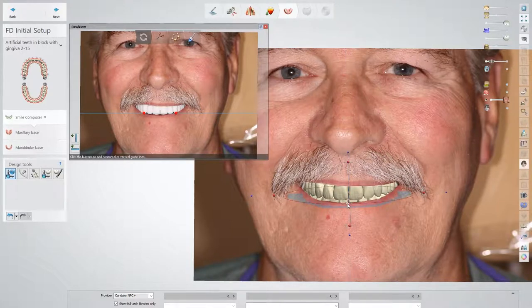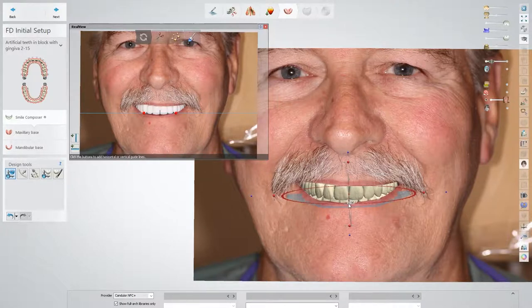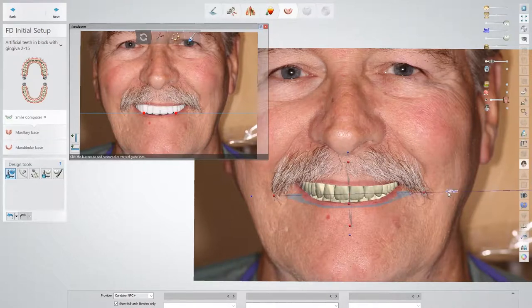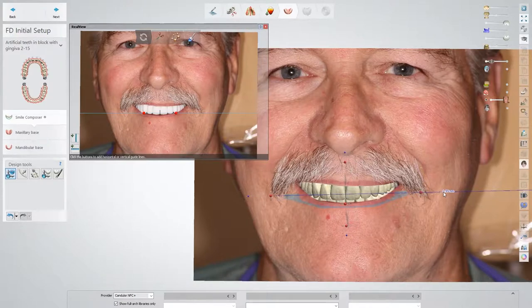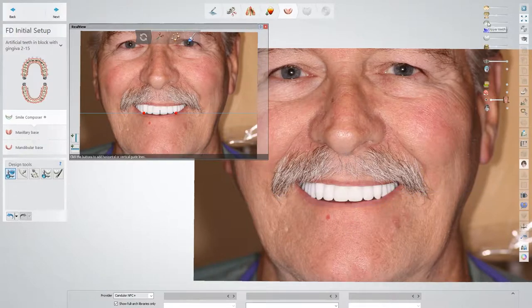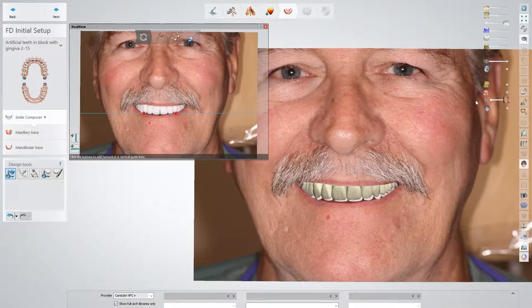We can still make sure that it follows the lower lip line. If we need to make adjustments to midline, we're able to do it with this tool — move it to the left or to the right. We're also able to adjust the buccal corridors by shifting the entire setup left or right. There are a lot of different tweaks that we can make with this tool.